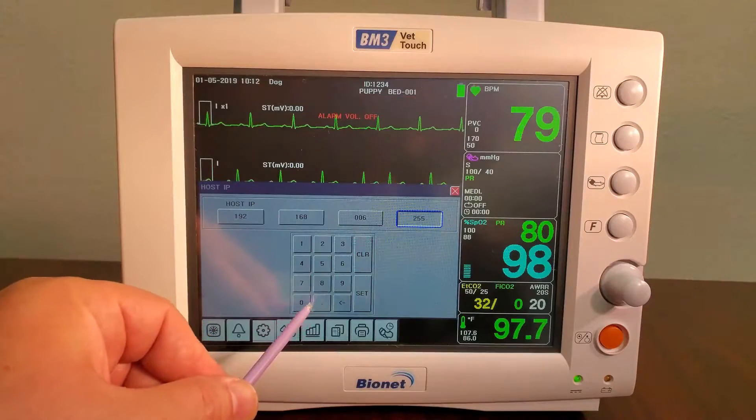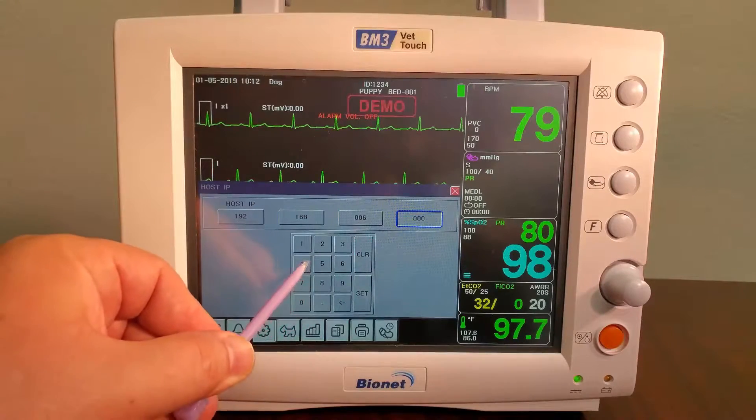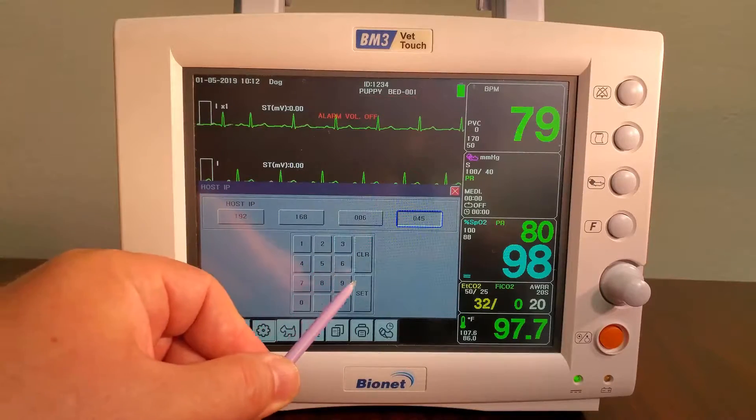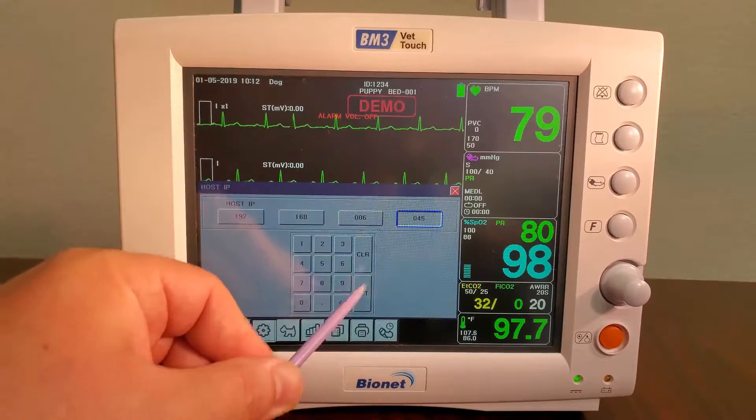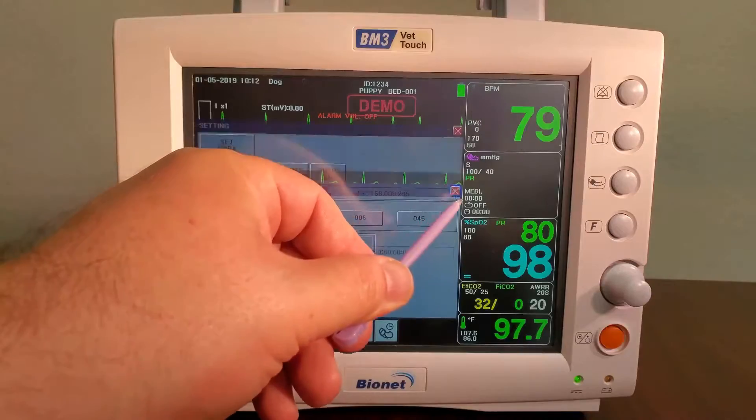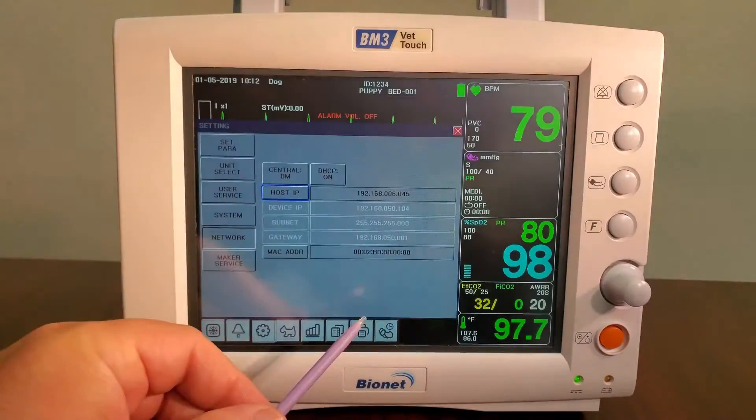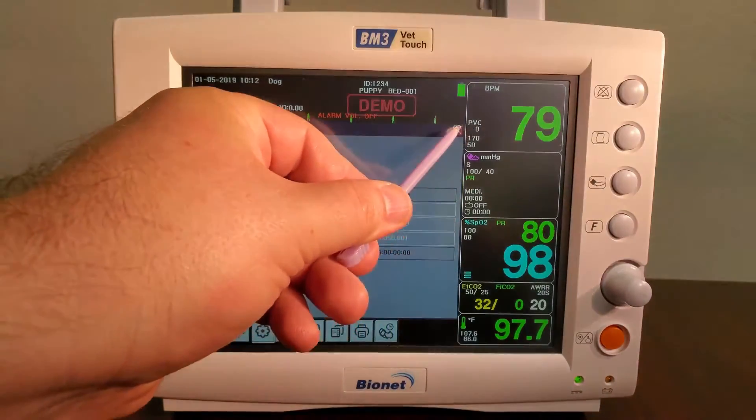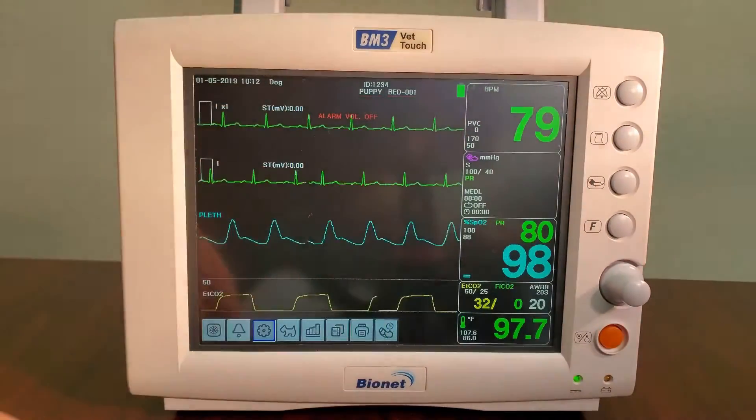Once this is complete, close out of all menus and then power cycle your unit by turning it off and on. This will save the IP address data in your patient monitor.